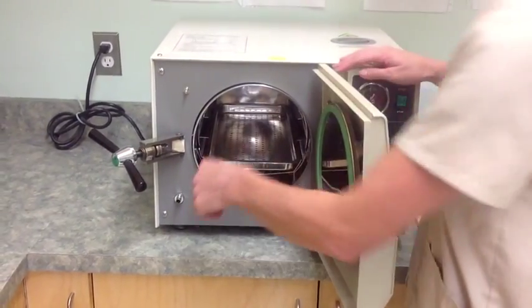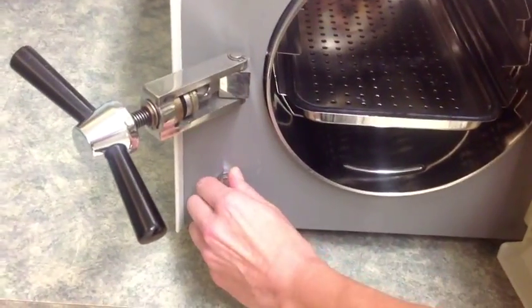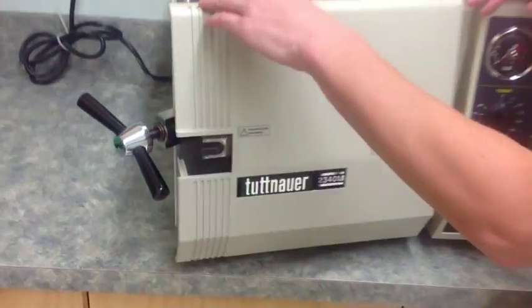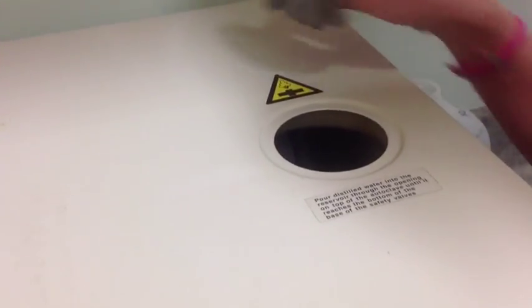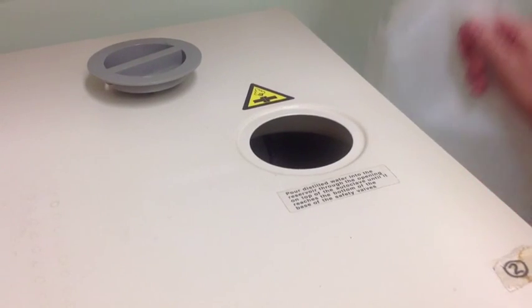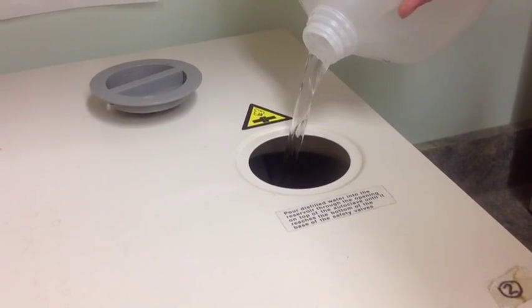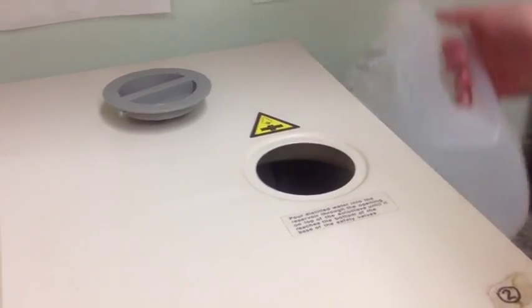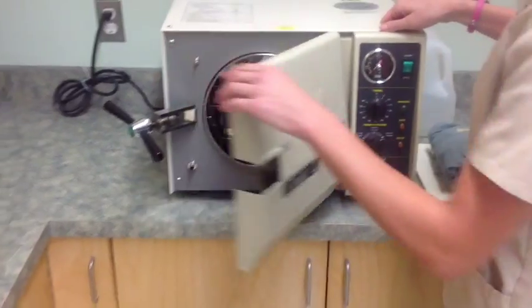Operating the Tuttnauer autoclave. Ensure the drain valve is closed. Remove the water reservoir cover and ensure the reservoir is adequately filled. Use distilled water only to fill the reservoir. Do not fill the water past the base of the safety valve.